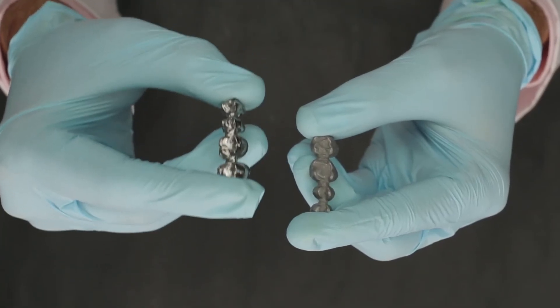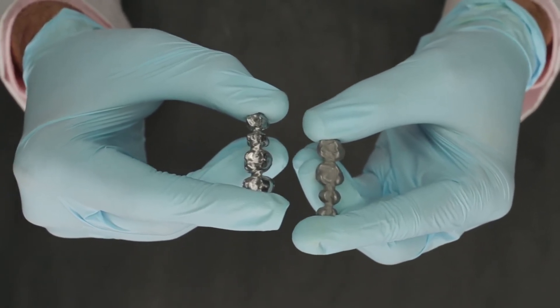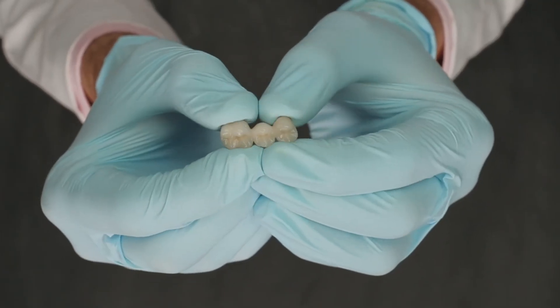This is the Delight framework which I have in my right hand. You can also see that it looks much different from the conventional cast alloy on my left. This framework is then layered with porcelain to get the final product.